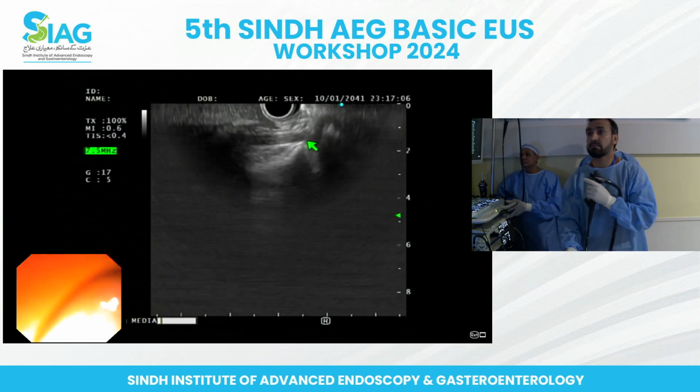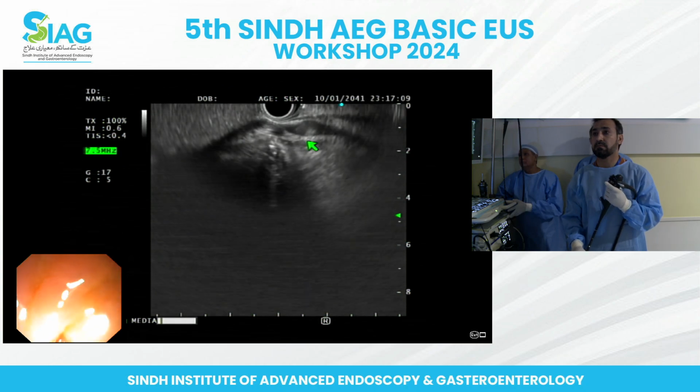Insufflate and push the endoscope down into the distal duodenum, just like ERCP.